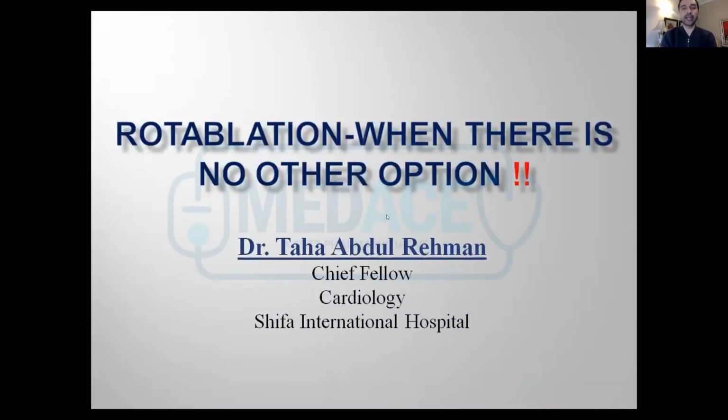The other was a question we had regarding the Propofol. A lot of questions regarding Propofol, that is, how you mix it in the solution that you use over here, Asad. Just in 500 cc of the flush, I would just put in 1 to 2 cc of Propofol.